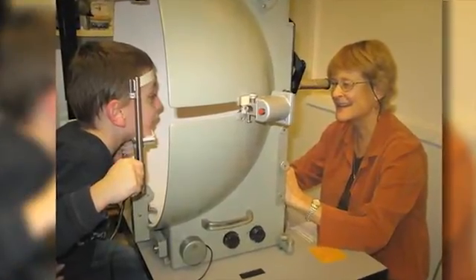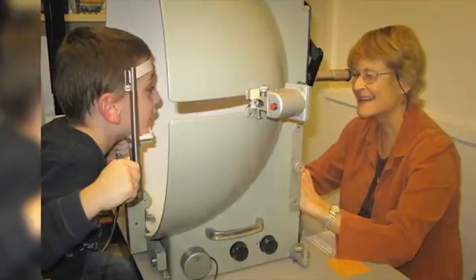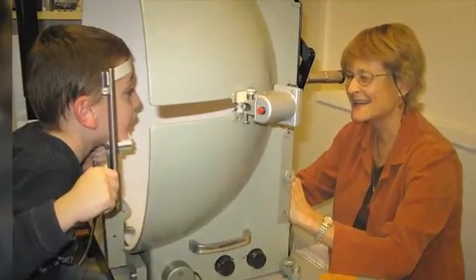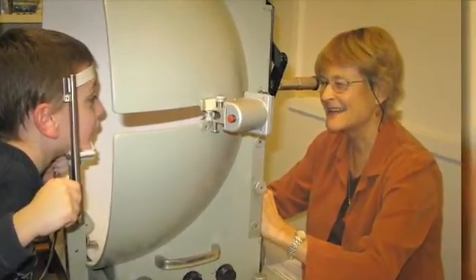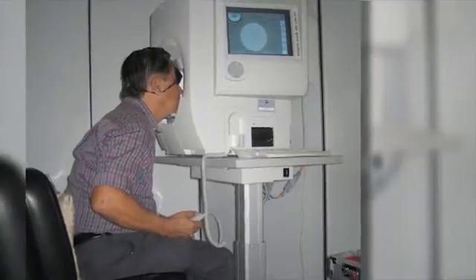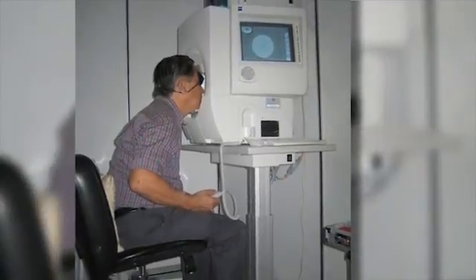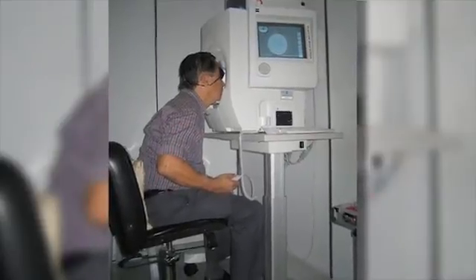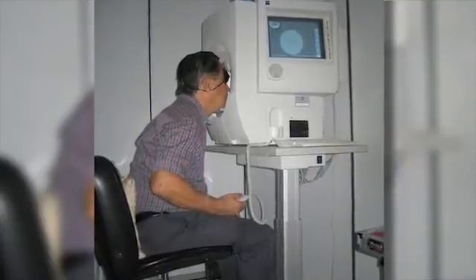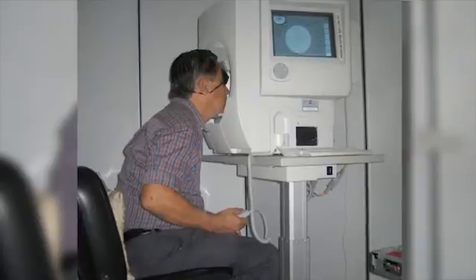In a photo, we see a young boy being tested by an examiner. His chin and forehead rest in a fixed position, and in his hand he grasps a buzzer. When they see the light, they press the buzzer. The same thing is done in the Goldman and in the automated static perimeter — only the light moves in one situation and not in the other. We see a photograph of a patient at an automated static perimeter device, with a patch over his right eye since only one eye is tested at a time. A screen displaying the plot results is visible on the side of the machine.